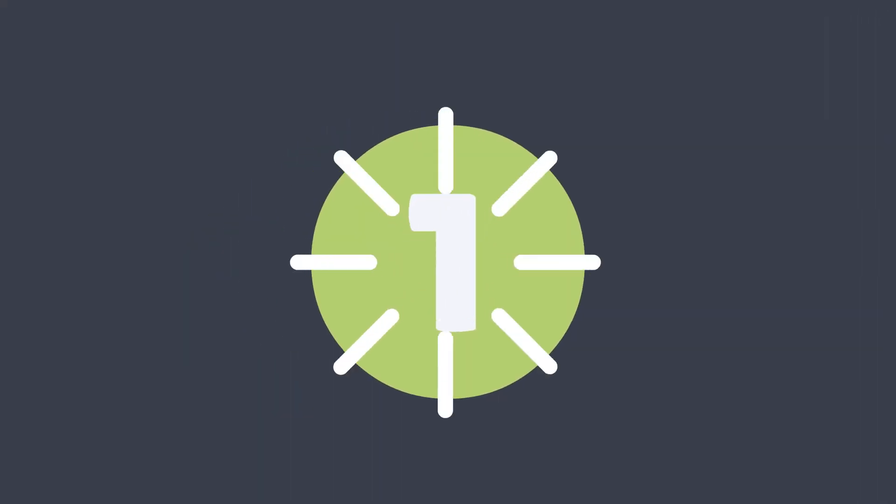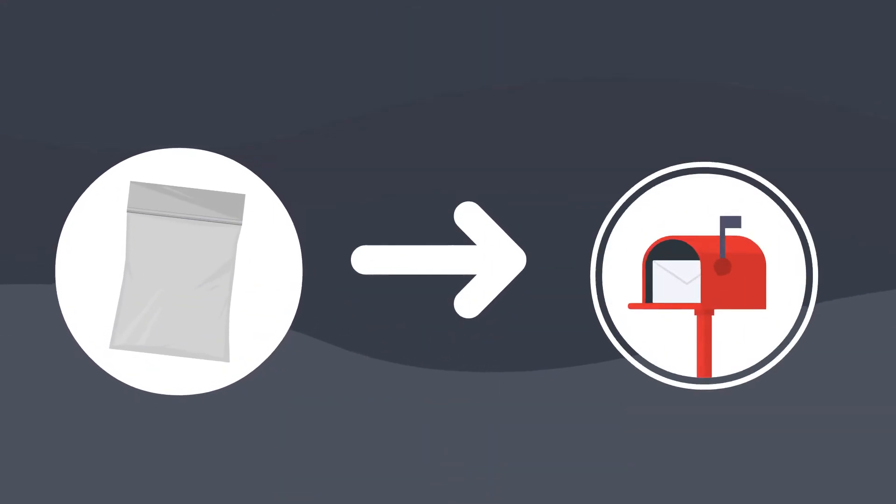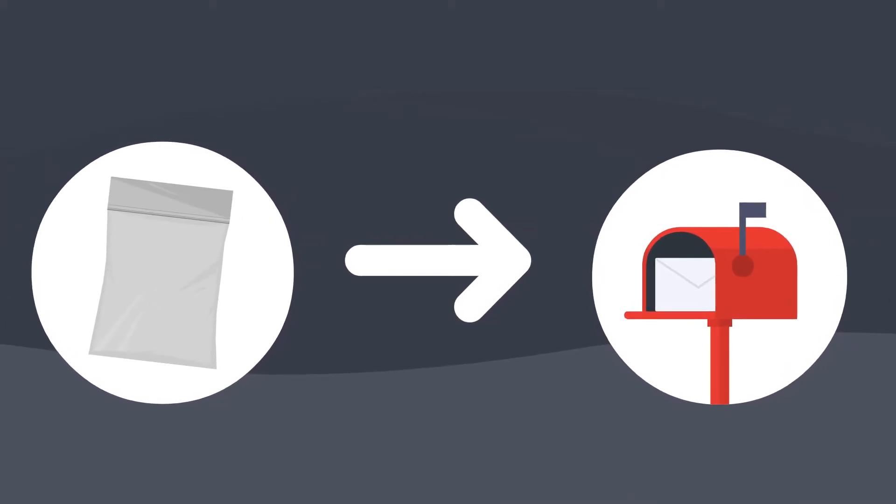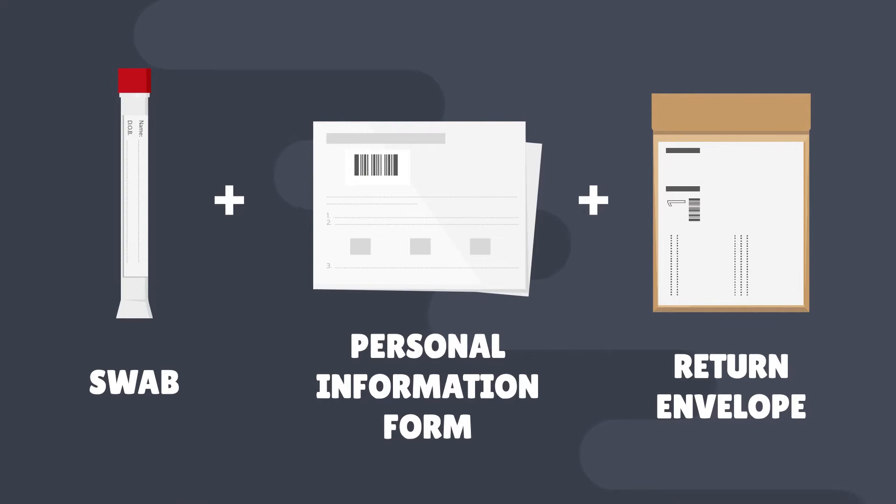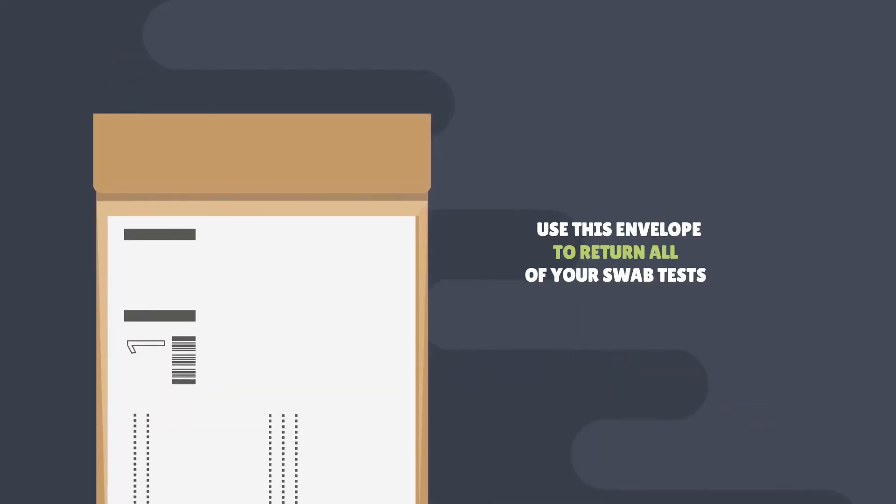Step 1. When you get your test kit in the post, open it. The swab, personal information form and return envelope will be inside. You should use this envelope to return all of your swab tests. Start by taking the sealed swab from the package.